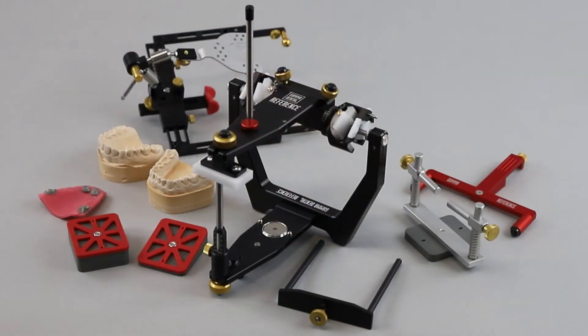For transferring the dental casts into the reference articulator you need the articulator itself, the upper and lower jaw model, the bite registration, the reference AB face bow with fixed bite fork from the patient, different distance blocks with pre-mounted mounting plates, the face bow support, bite fork support, and the mandibular mounting clamp.